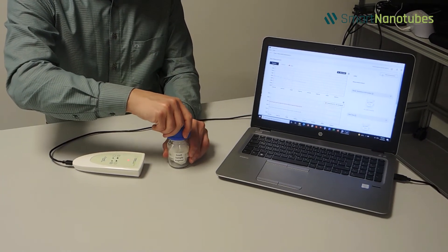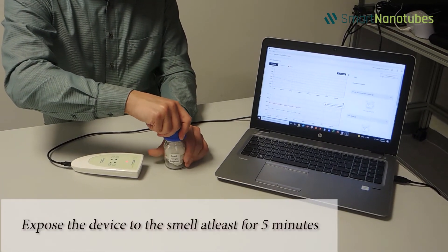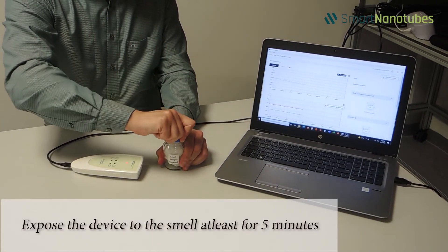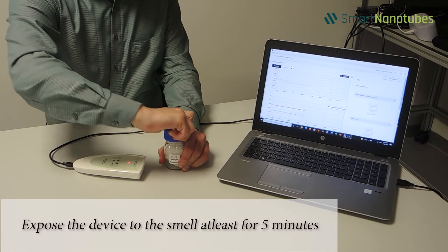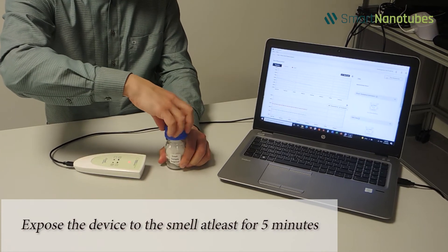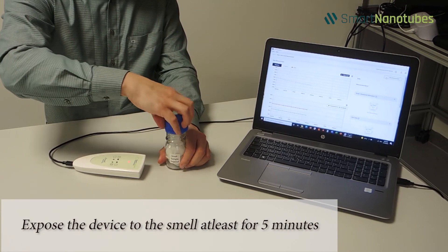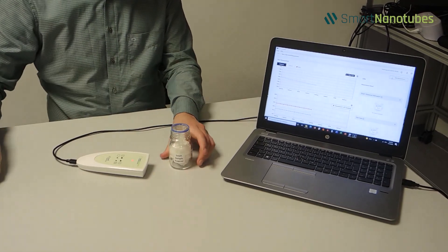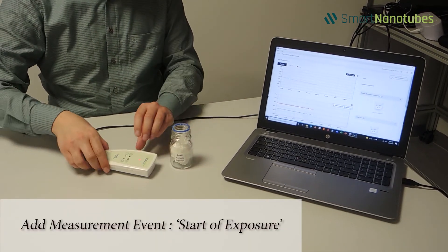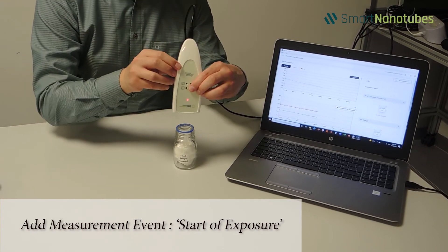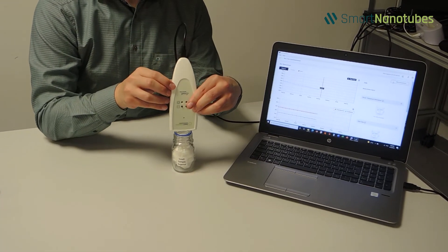Now, expose the device to the target smell for at least 5 minutes, or until the graph reaches the plateau or stable response. Please add a measurement event and name it Start Exposure.